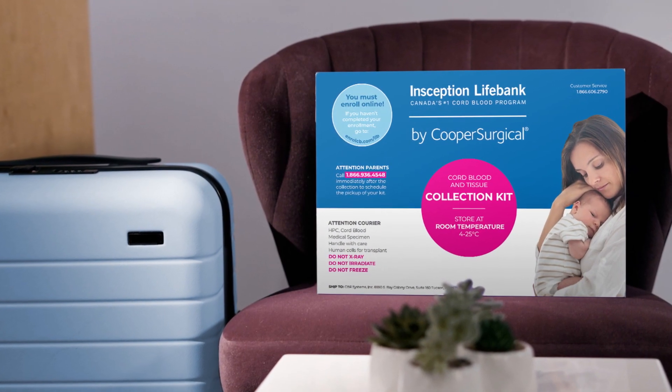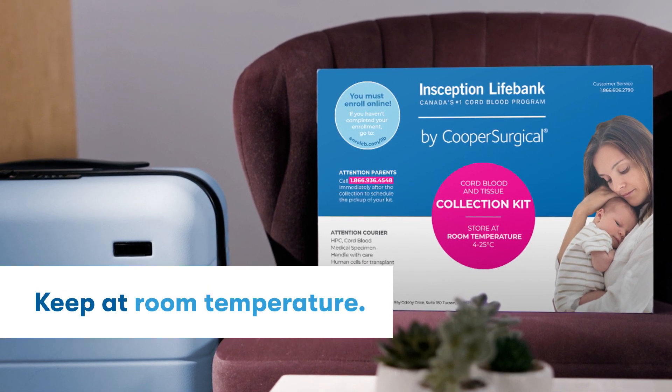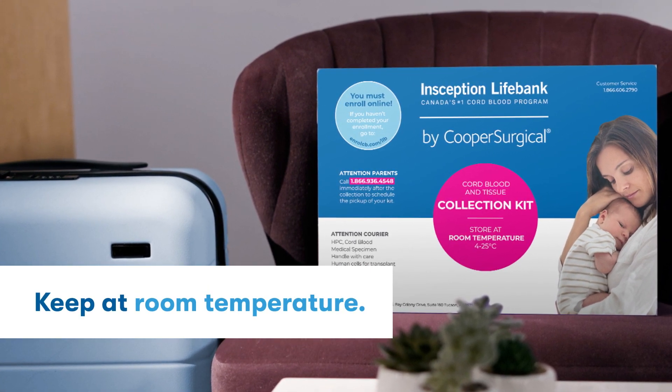Now that you're familiar with your kit, you can put it in with your go bag for the big day. Remember not to store your kit in the car and to keep it at room temperature.